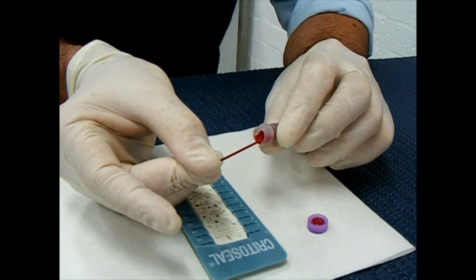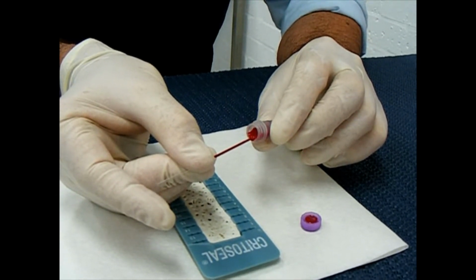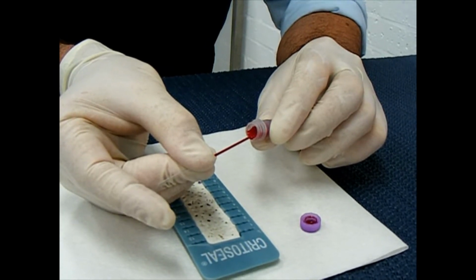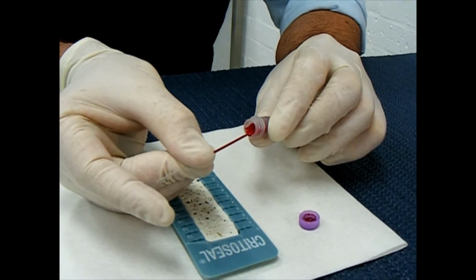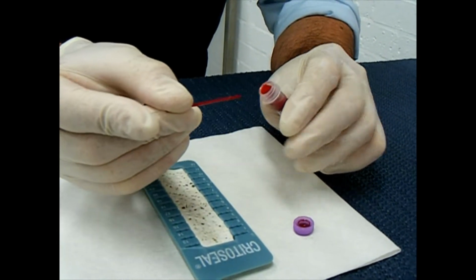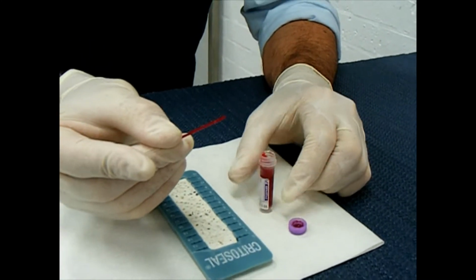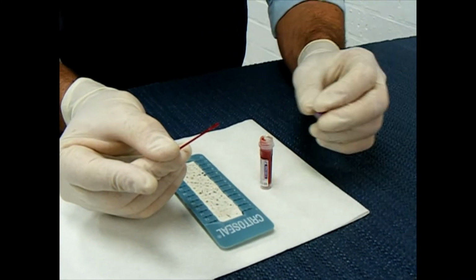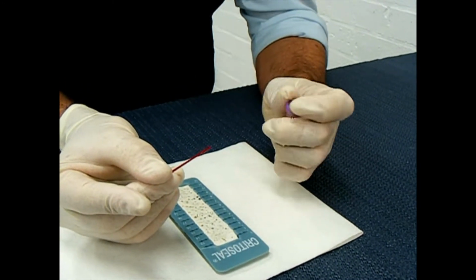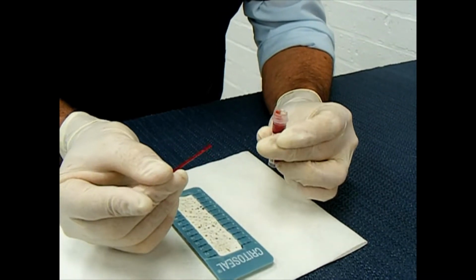And at the end we're also going to use the plasma from this tube, so it's a good idea to fill them as much as you can. Okay, that's reasonably full. I put my finger on the tip now. I make sure that the blood, I put the lid back onto the tube straight away, because otherwise you'll knock it off. Ooh, like that, that's not very good.